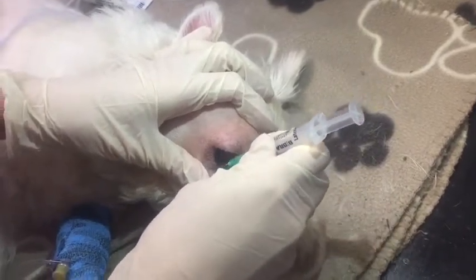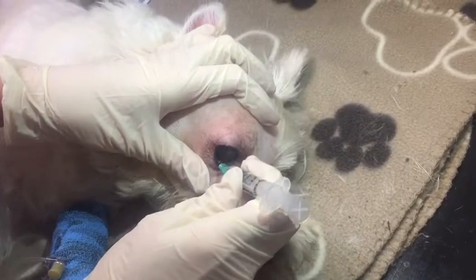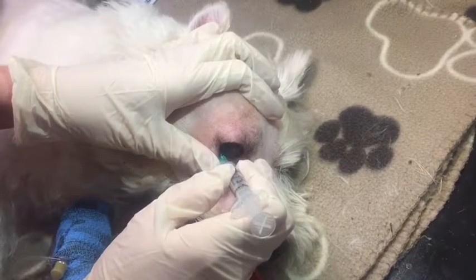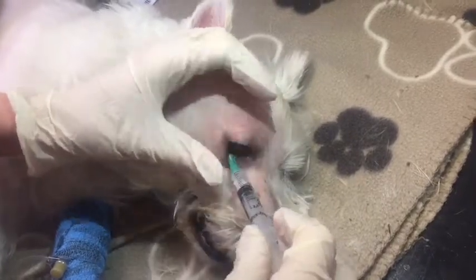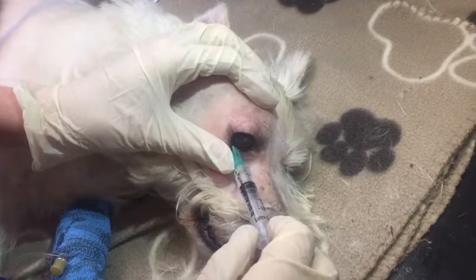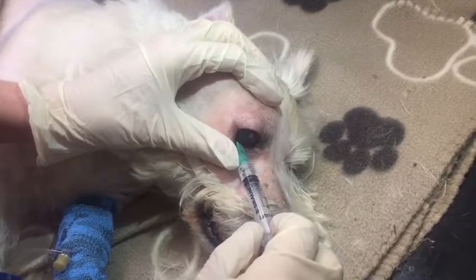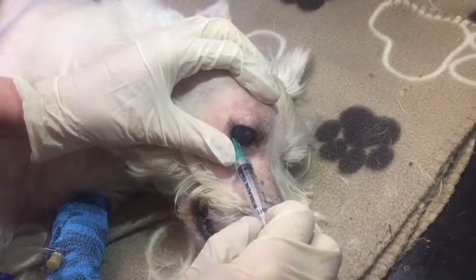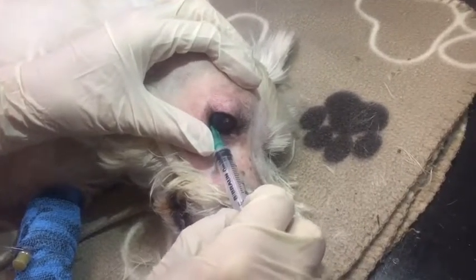Palpate the inferior orbital rim and aim your needle for the lateral third of the eyelid. You then want to advance the needle through the conjunctiva around the back of the orbit. You'll notice a slight pop when the needle pierces the orbital fascia. Continue forward just another 1-2 centimetres until you're at the back of the eye.